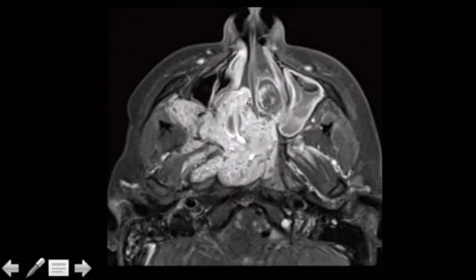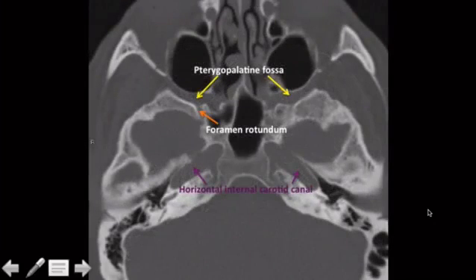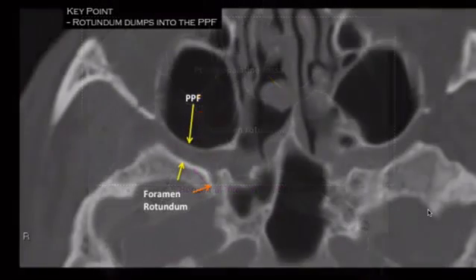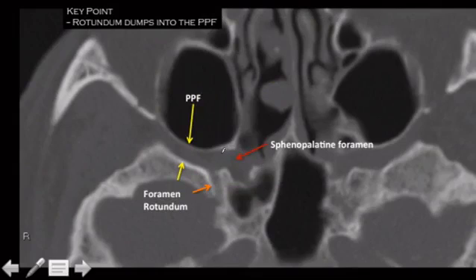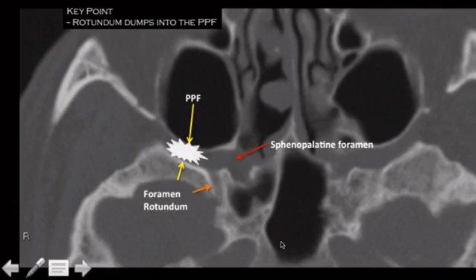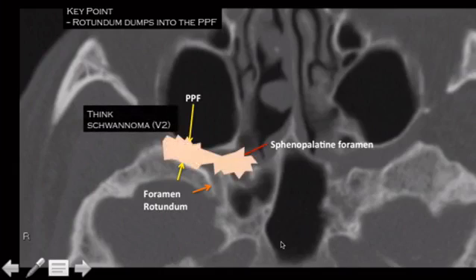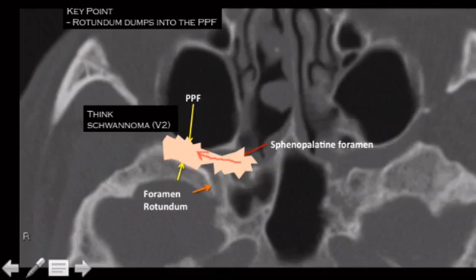Next case — this one is maybe in the sphenopalatine foramen, growing into the pterygoid palatine fossa (PPF). Quick anatomy review: this is the sphenopalatine foramen here, see how it connects with the PPF. The foramen rotundum also shows movement down there. If a tumor just sits here, you might think schwannoma of V2. But if it starts here and grows in this direction, that is your JNA — starting in the sphenopalatine foramen, growing into the PPF.